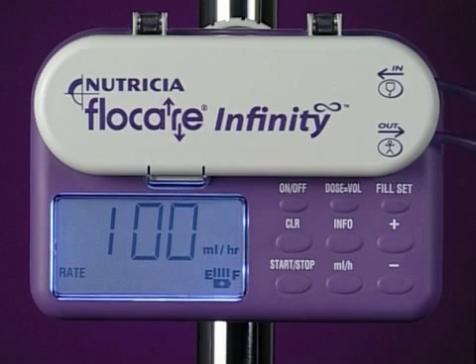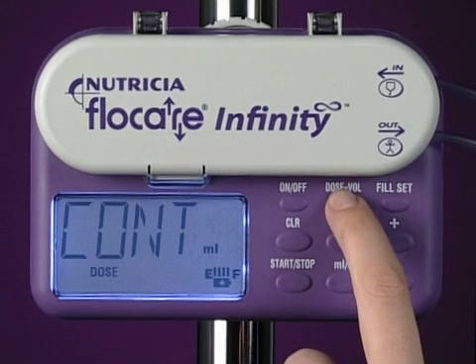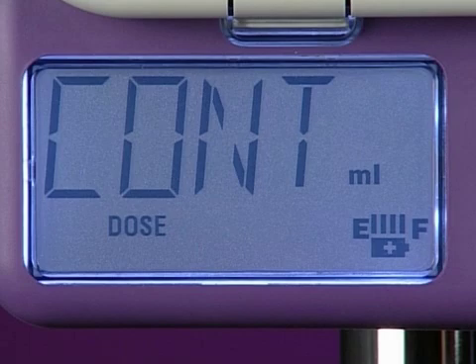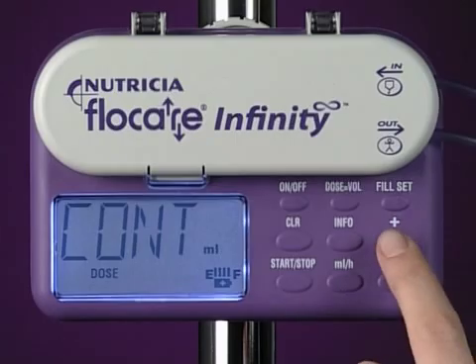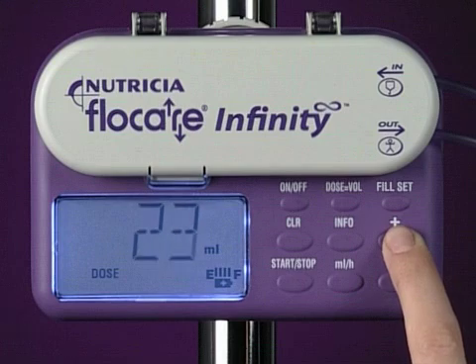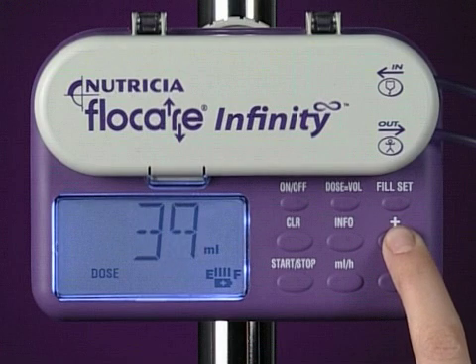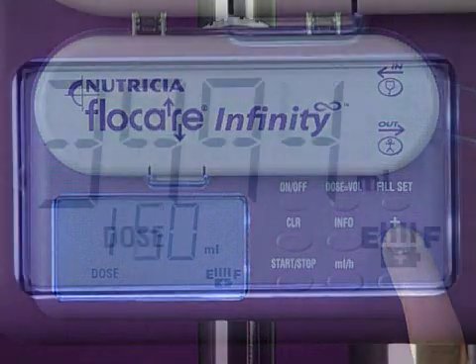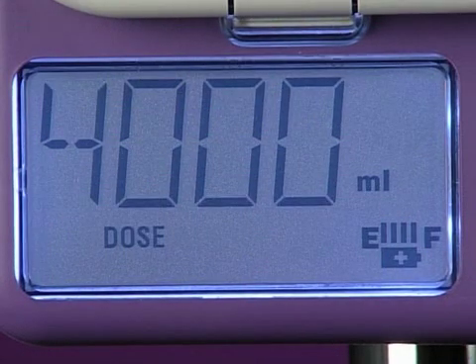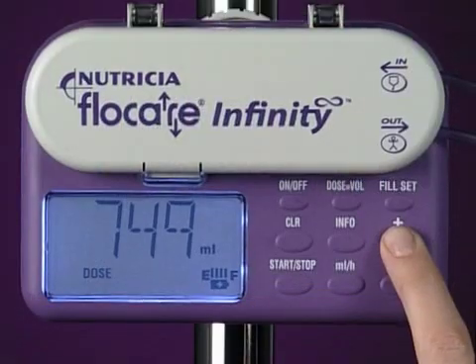After you've entered the flow rate, press the dose equals volume key. The abbreviation C-O-N-T will appear in the display, denoting continuous feeding. Using the plus and minus keys, enter the dose to be delivered. The range goes from 1 to 4,000 milliliters in 1 milliliter increments. Once you set the dose, press the start stop key as before.